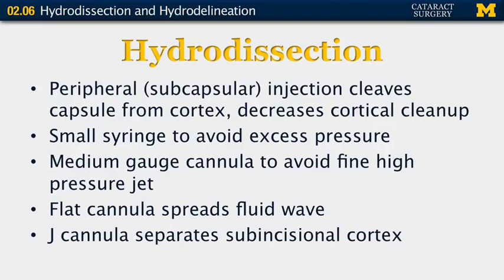In hydrodissection, there is a peripheral subcapsular injection that cleaves the capsule from the cortex and decreases the need for cortical cleanup later. A small syringe is used. If a large syringe is used, the pressure is excessive, so we don't want to create too much pressure, but we want to create enough pressure to separate the tissues.